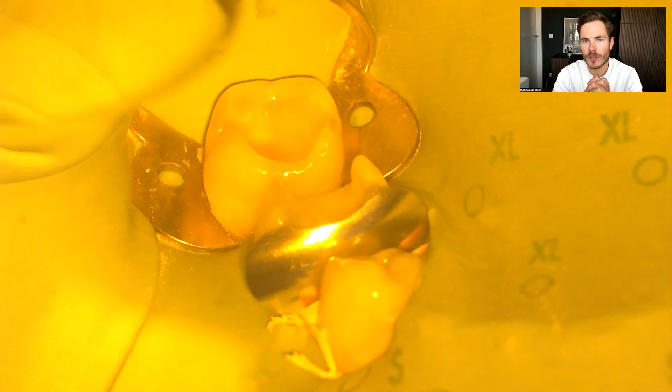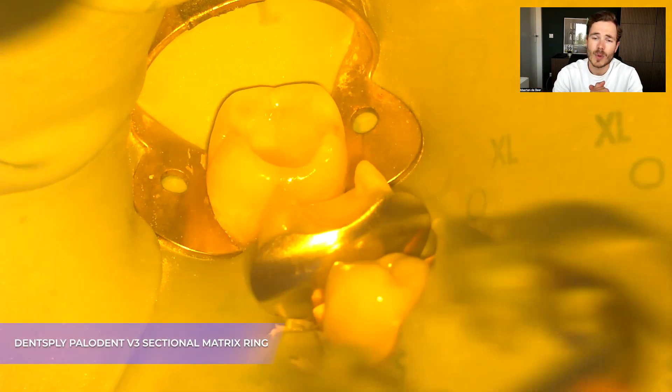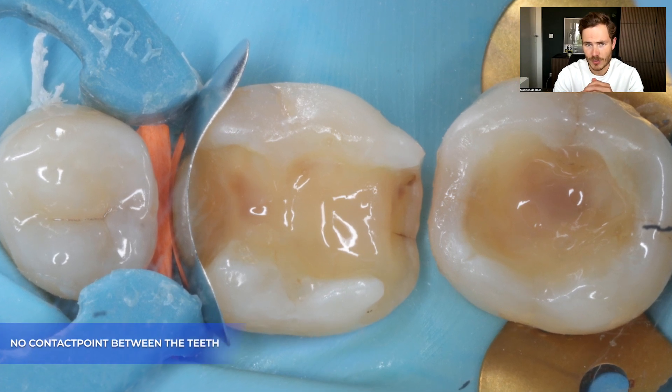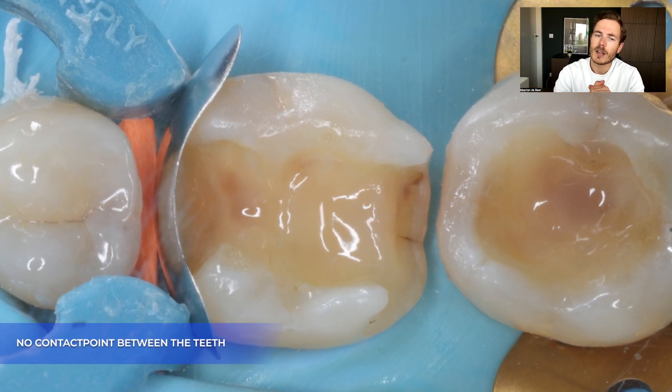I was now ready to restore the mesial side of the first molar. We can see that we don't have a passive contact point, so we have two options. One option is to leave the patient with an open contact point, which in this case will be around a millimeter. We could also put a lot of pressure on the matrix band to deform it, but then we get a really bad contact point. The other option is to first put a little bit of composite on the second premolar — if we make the tooth a little bit wider with some freehand composite, we can recreate a natural contact point.